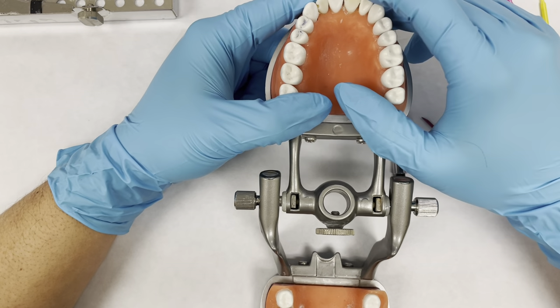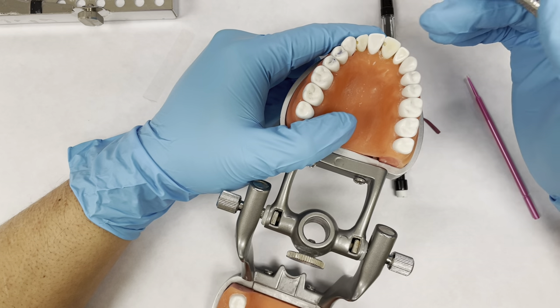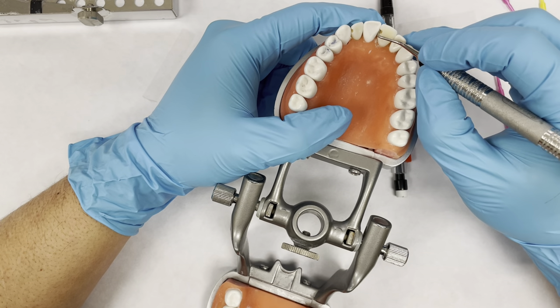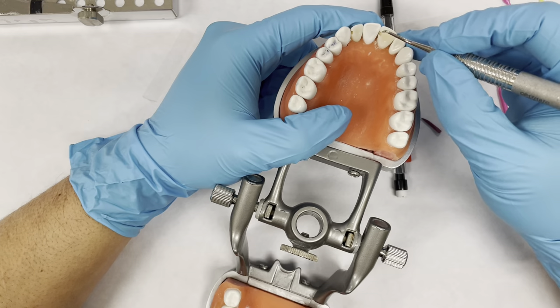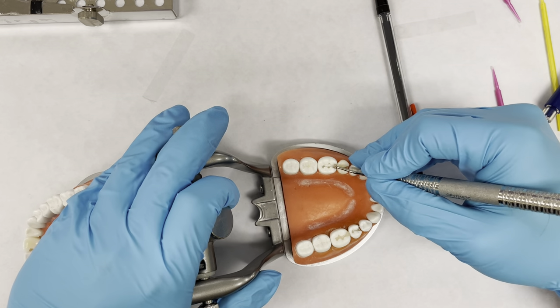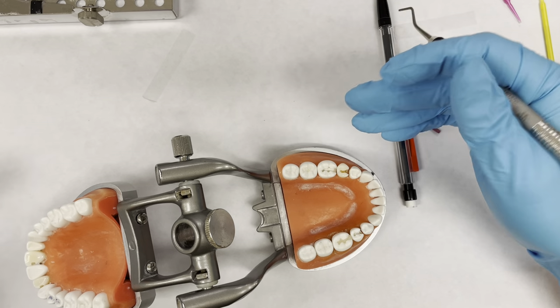A couple of tips as far as making your boxes nice and square: a lot of times we like to use the enamel hatchets. However, these typodont teeth are very brittle and it's very easy for them to just fracture, especially on exam day. So if you're going to use your enamel hatchet, make sure you use very light pressure and just slowly shave it down. Don't do the traditional drop-it-in-there approach where you hear that satisfying chunk sound — you have to go very slow. If you put a lot of pressure, you can just snap off the enamel and take some of the tooth with it, because these aren't real teeth.